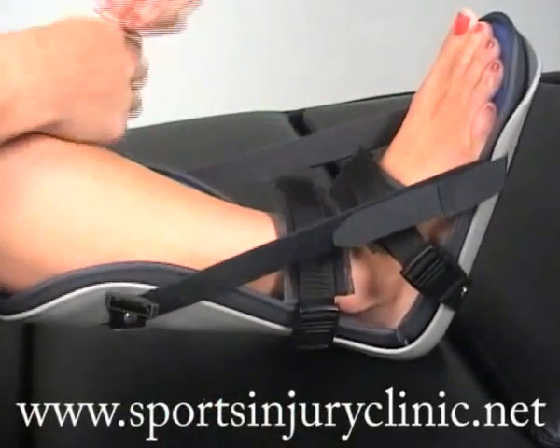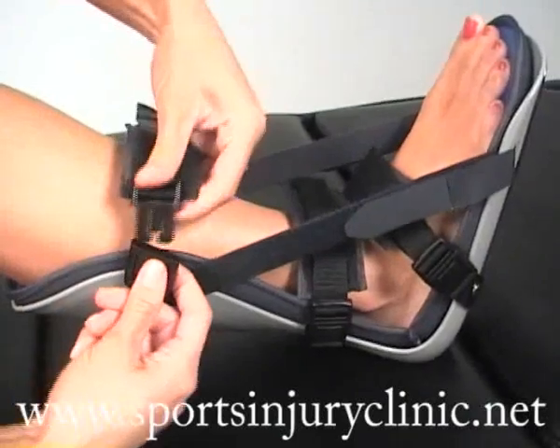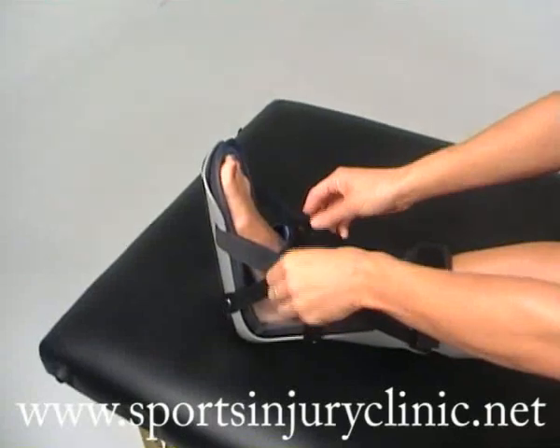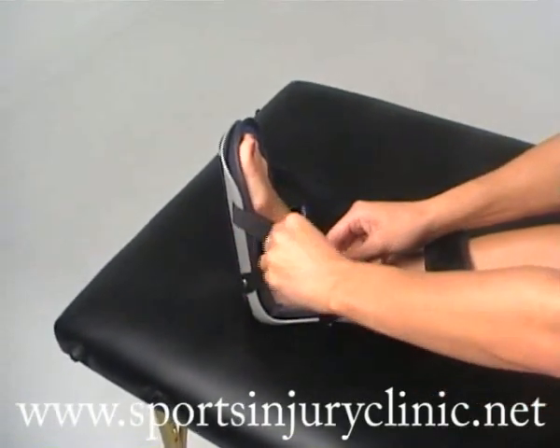It's important not to have it too tight to start with, or it may become painful later on in the night as the muscles tighten up. As you become accustomed to using the splint, it can be tightened with the straps at the side to give additional stretch.